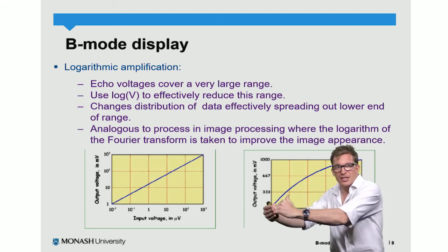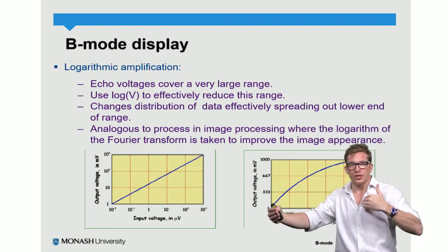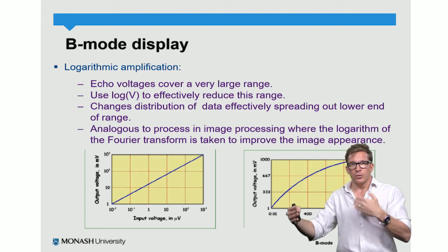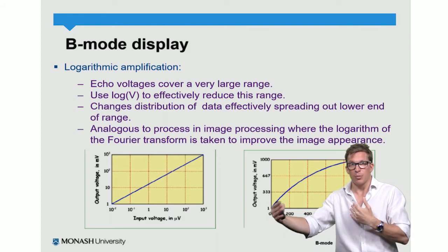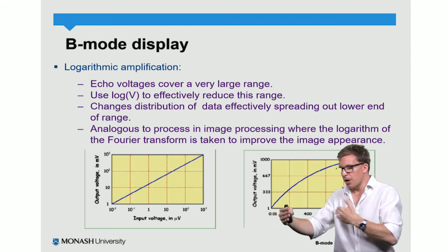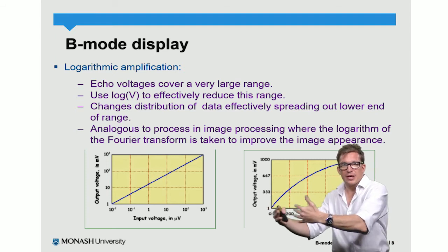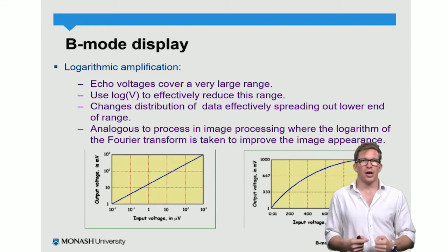And then when it's reflected, it has to come all the way back again. And that reflected energy is going to also be attenuated on its journey back to the transducer. So just because an echo is coming from a strong reflector doesn't mean it registers as a strong reflection on the transducer. In order for that to occur, which is indeed what we want, because if there's bone there at a depth, we want to know that it's there at a depth, what we need to do is apply a correction for the fact that the deeper something is in the patient, the weaker its reflected echo is going to be because of the attenuation of that energy. And that's called time gain compensation.